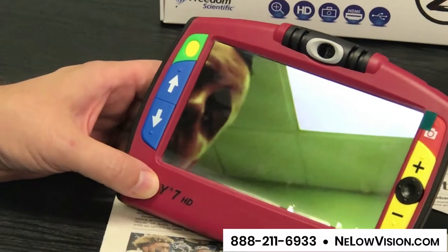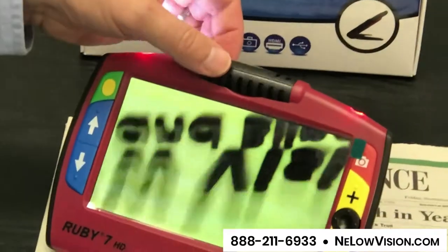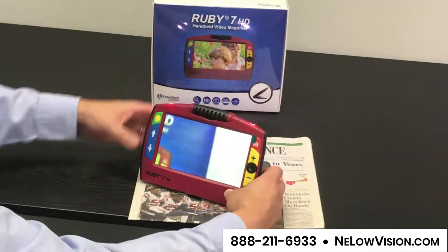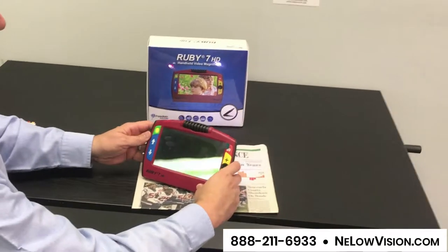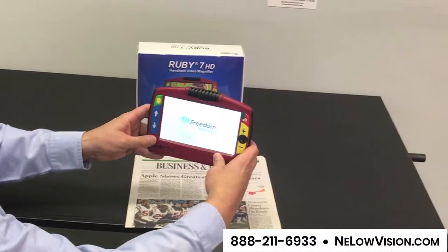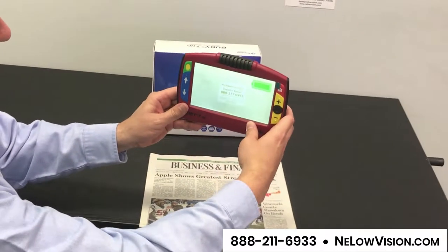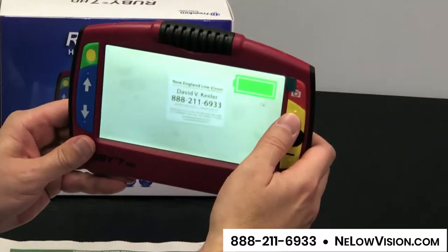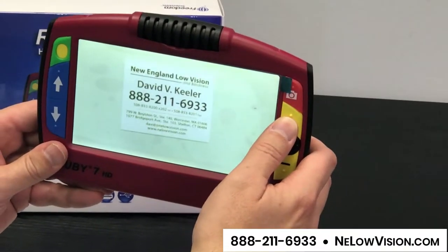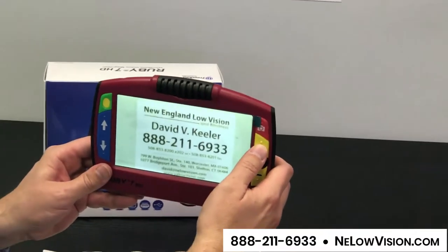Another feature is you can twist that camera for distance viewing. So if there's something at a distance, you can close the device, turn it back on, hold it up to something on the screen and zoom in and bring that in — like a menu at a McDonald's or Dunkin' Donuts.